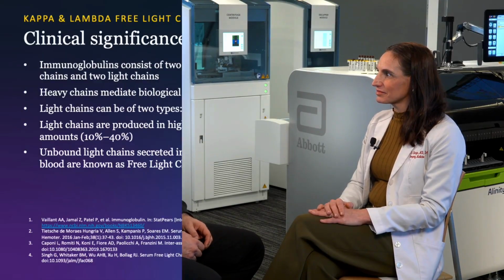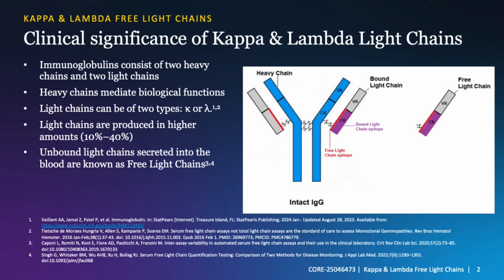David, thank you so much for joining me today to talk a little bit about the new Kappa Lambda Free Light Chain assay and our patients with multiple myeloma and other monoclonal gammopathies. So Alexa, can you tell us about Kappa Lambda and the free light chains and what disease states they're associated with? Absolutely, David.